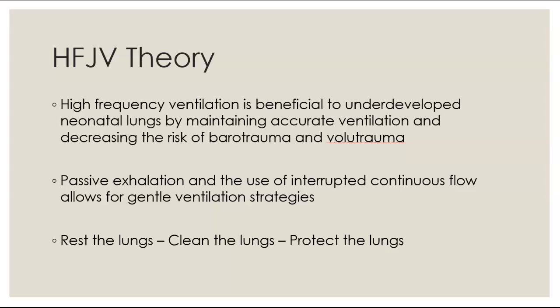The passive exhalation, also how it is given, we use measured pressures, but we give this high frequency ventilation through interrupted continuous flow. So between that flow interruption and passive exhalation is what allows for this gentle ventilation. And unfortunately with gentle, just like I said, it can take a while. It can take a little bit of a commitment to get those lungs open, get them recruited, get ventilation, get oxygenation going. But the long-term effects are very beneficial.